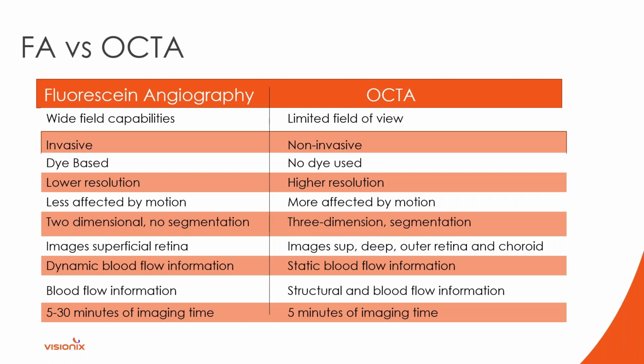And really, what I would summarize as the last thing here is that OCT angiography is very, very fast, whereas FA takes time. Patients have side effects from the dye. So you have to be more careful when you recommend a patient have FA versus OCTA. I mean, you can do OCTA 10 times in a row and there's really no negative effect, except maybe dry eye for the patient.